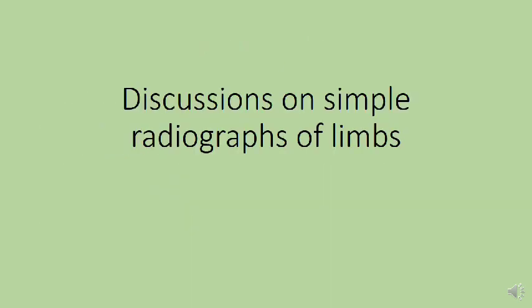In this module, we are discussing some simple radiographs of limbs. Before we proceed to look at the protocol on which we should read radiographs of limbs, I have a question for you.